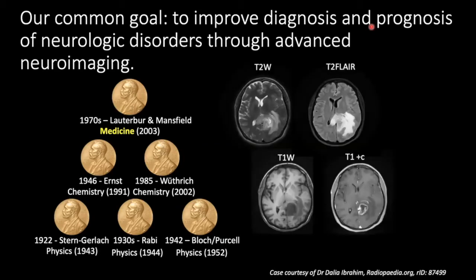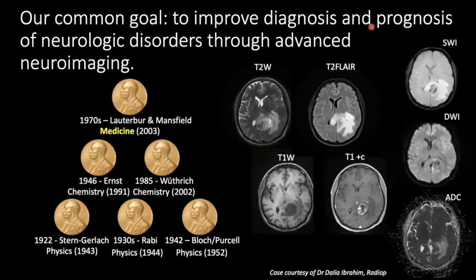And we know that this is used clinically every day to afford many different types of contrasts that can let clinicians know the prognosis of a particular patient. This is, for example, cancer. And I think, within this, there's a real push to advance beyond just tissue contrast and be able to use some advanced sensitization of the MRI paradigm and also mathematics for quantitative MRI.